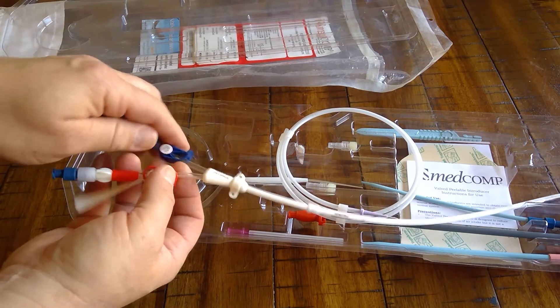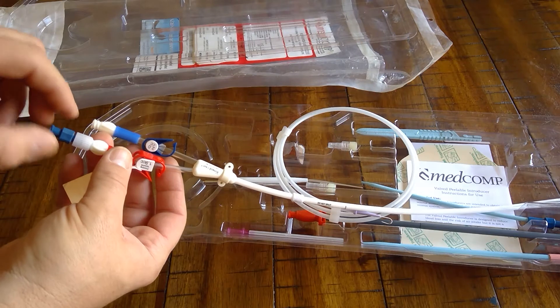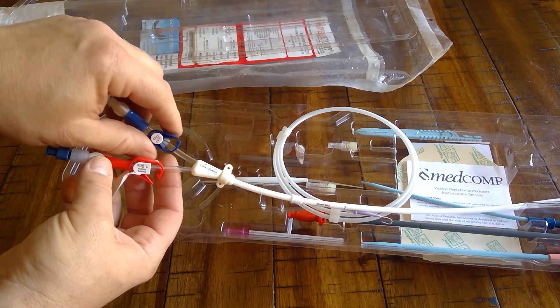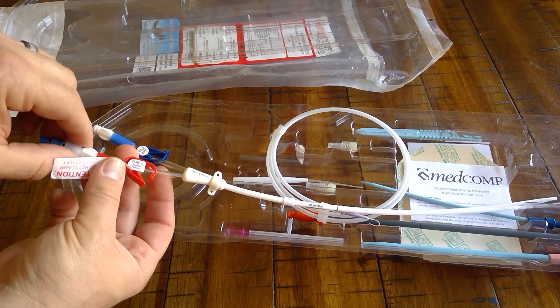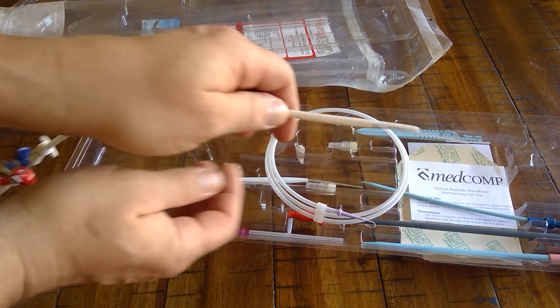The stylet is only for over-the-wire exchanges. When prepping for an exchange, make sure the stylet is snug, flush and clamp the blue lumen. Do not clamp the red lumen as the tag states — just flush it. Then remove the catheter from the package.